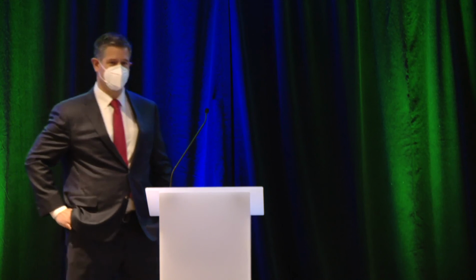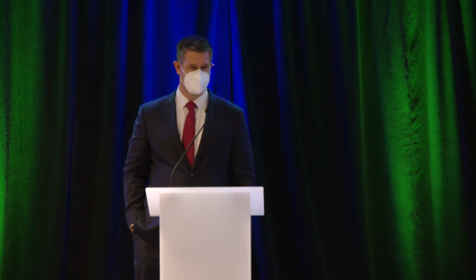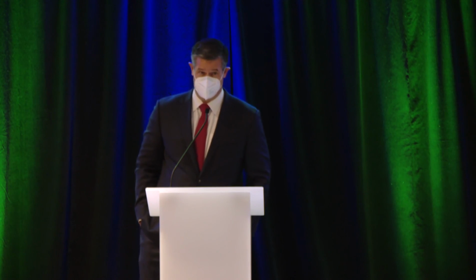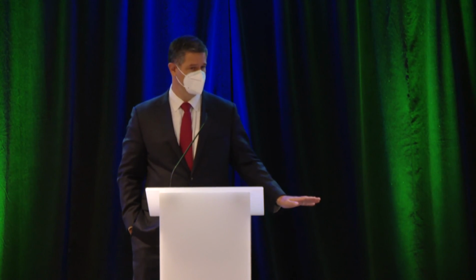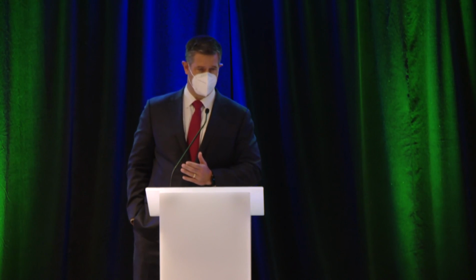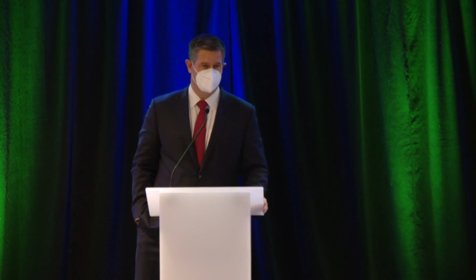Yes. Just, wonderful points. However, we have to remember that it is not the 10 best swallows you find, but 10 clean swallows. I agree the patients who gag or double swallow are excluded, but saying to do 15 or 18 swallows and find the 10 best is not the right answer. No, I agree with you, and that's definitely not what I'm saying. If there's clearly some technical challenge, throw them out so that you still have enough to evaluate. If you've got 18 swallows and all of them are free of things like immediate double swallows and gagging, then analyze them all.